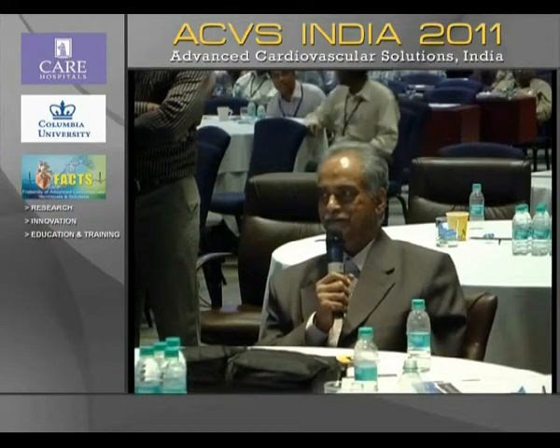Can't get your question. The covered stent was 3.5, sir. The previous stent that was put in initially was around 4, at very high atmospheres, and 3.5, conceptually how does it work? That's a pretty valid question.